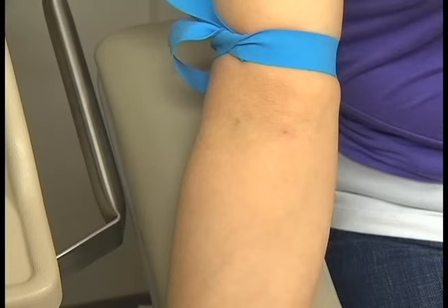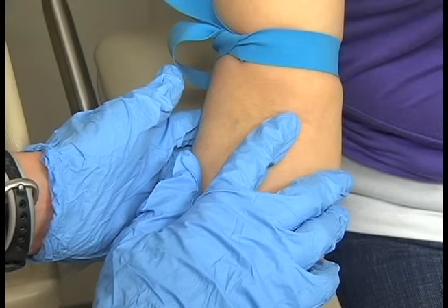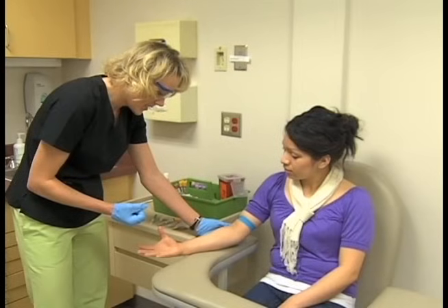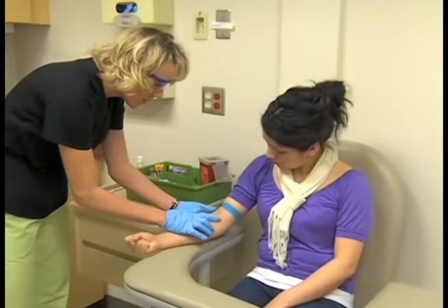The patient position for venipuncture is especially important to the successful collection of a blood specimen. Proper positioning allows easy access to the vein and is more comfortable for the patient. The most common site for venipuncture is the antecubital space. The patient should be seated comfortably in a chair with the arm extended downward to form a straight line from the shoulder to the wrist, palm facing up. The arm should be well supported by the armrest or a rolled towel.